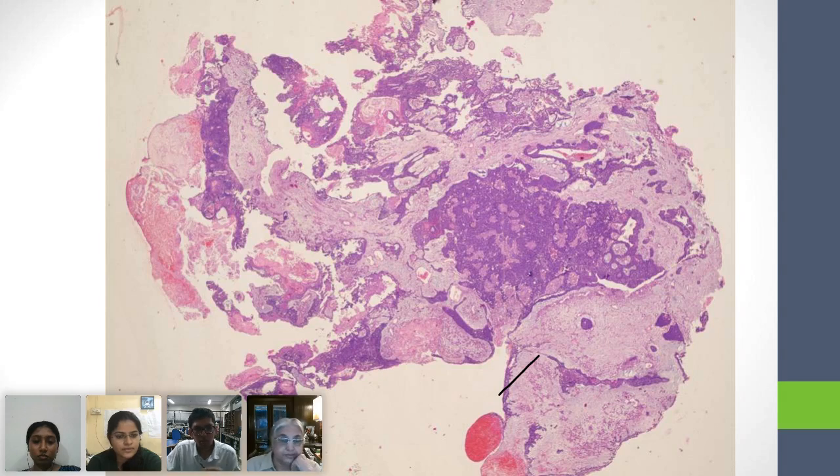say? Ma'am, I disagree. I don't feel that it is a normal epithelium over there. Okay. So do you see any normal tissue at all? No, I don't see a normal tissue. You don't see any normal tissue. What about Neelam? Neelam is not there. Neha? Ma'am, I don't think there's anything normal in this.